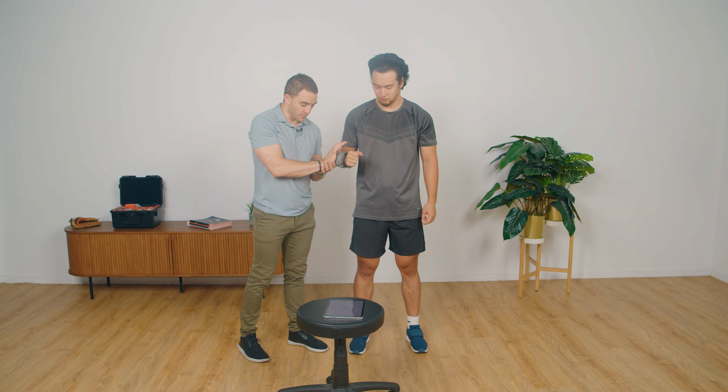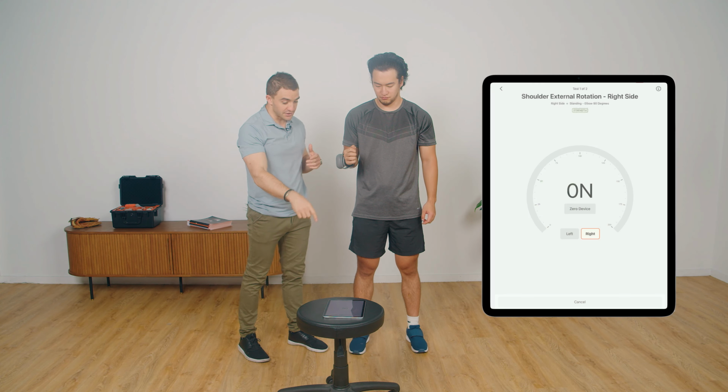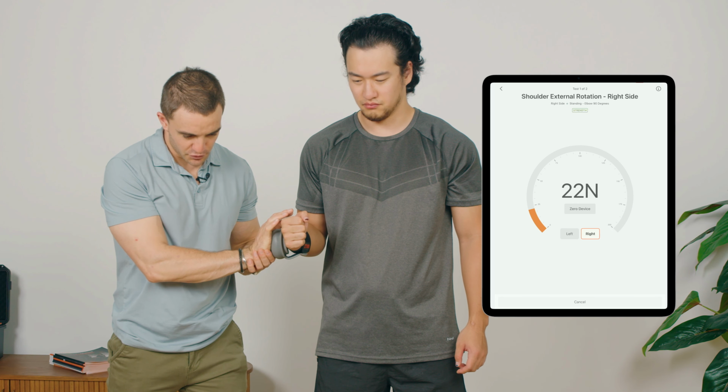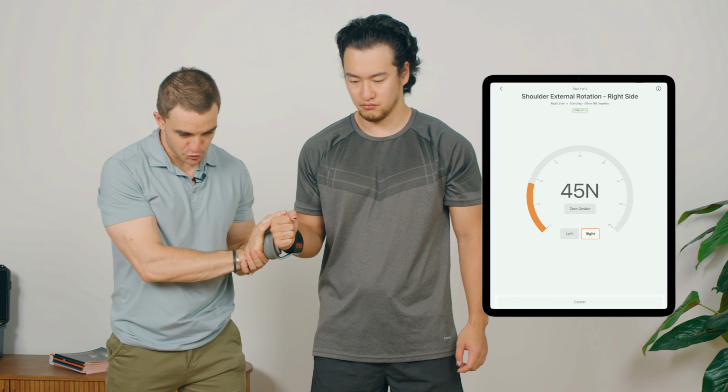So I'm going to place my hand here, and I'm going to say, Cal, I just want you to push in until the dial hits 50 newtons, which is roughly 5 kilos. So nice and gentle, go ahead and push into me. Push, push, push, and relax.